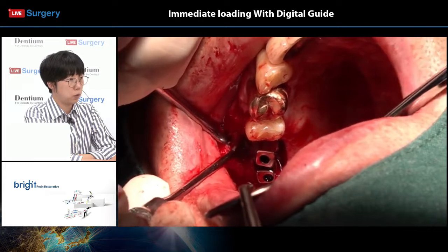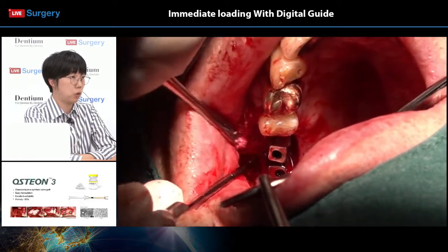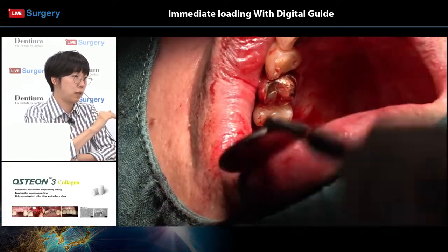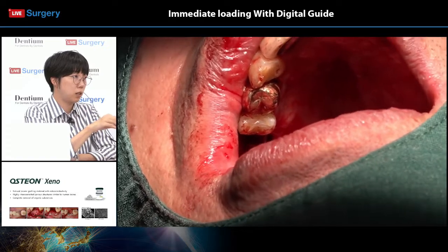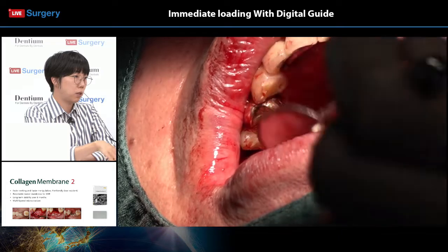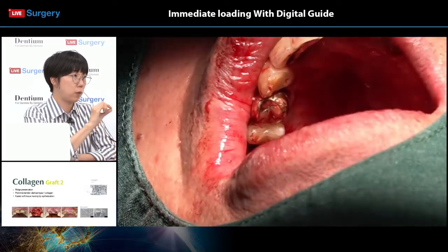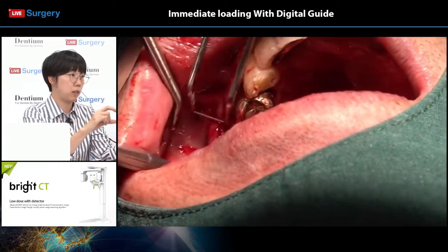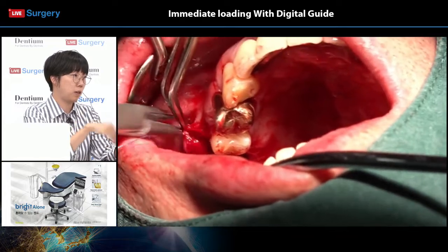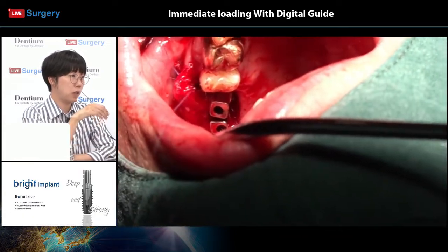When performing bone graft on a buccal side of the implant, please make sure that you push your graft material a little more apically before closing your flaps, because usually in cases, some surgeons forget to do this and they have bone graft only on the collar side of the implant, but we want more bone in the apical area as well. So please try to push your graft material apically.